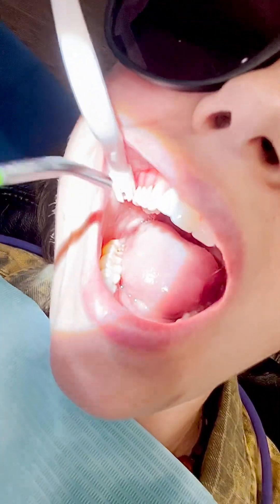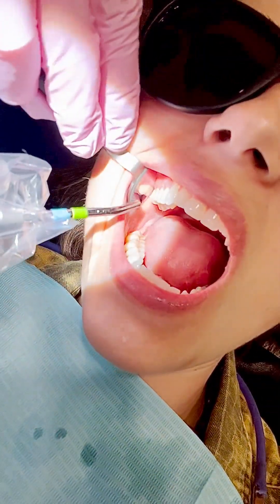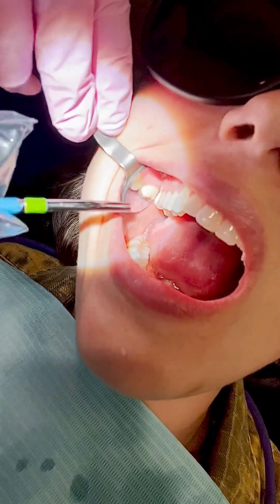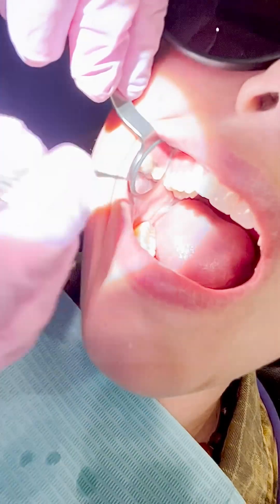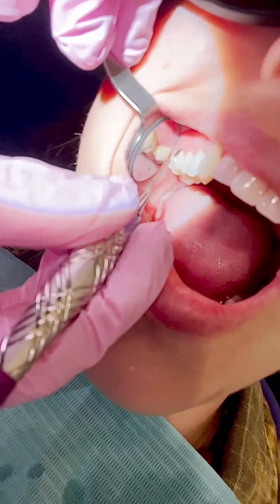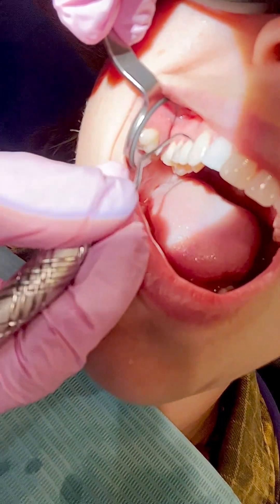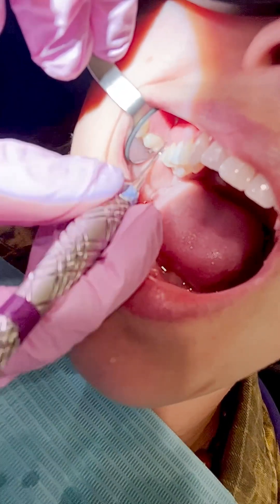So now I'm going to suction because she's bleeding a little, and it helps me to continue to see where I'm scaling. Now I'm blowing air — blowing air is my favorite technique. This is how we check for remaining tartar and calculus. You'll see a chalky whiteness if you blow air. I'm coming in here with a universal, like an anterior universal going straight in. In this video, every different instrument is banded.